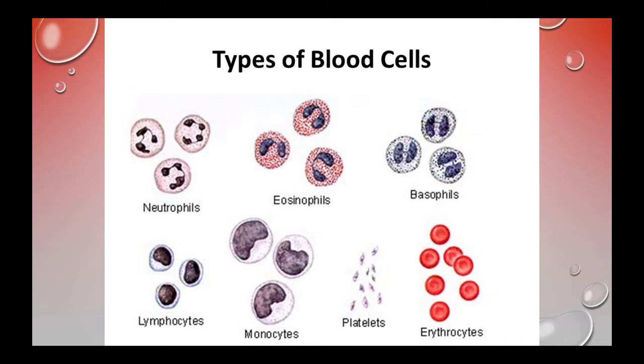You'll see that you have quite a few erythrocytes in just a millimeter cubed of blood. You'll have about 4,200,000 to 6,200,000 erythrocytes in just 1 millimeter cubed of blood. So very small volume. And so that's the erythrocytes. Then we have all of the leukocytes, which are your white blood cells. The leukocytes include your neutrophils, your lymphocytes, your monocytes, your eosinophils, and your basophils.